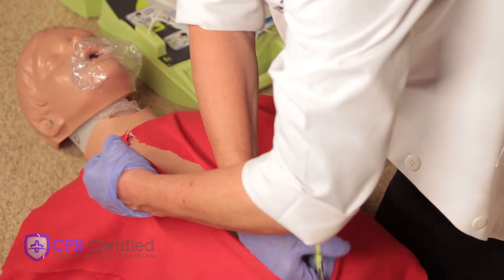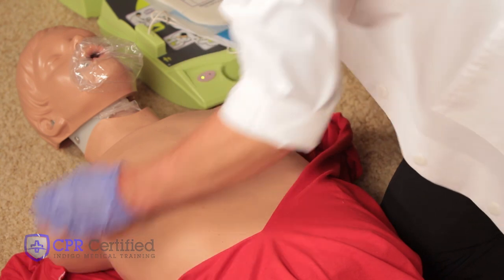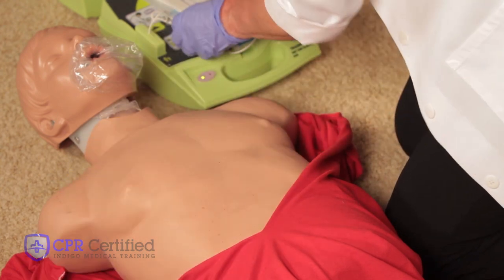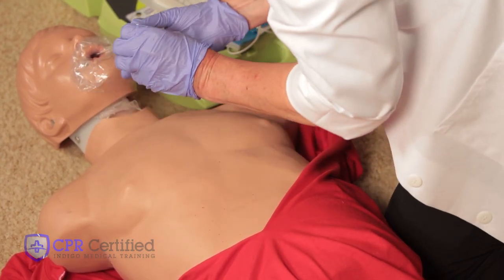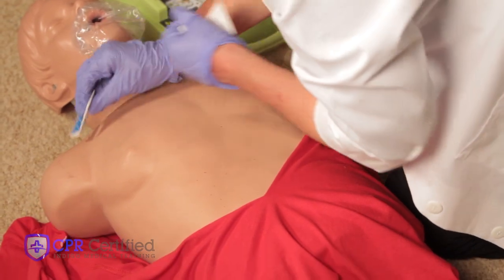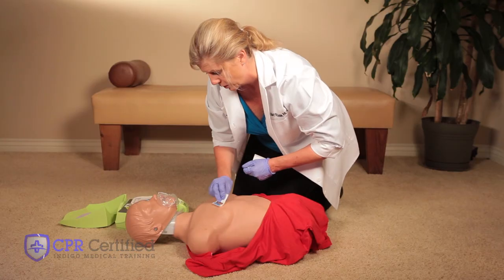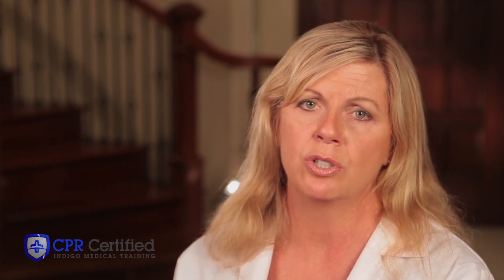If the victim has a hairy chest, use the razor supplied with your AED to shave the area where the patch is to be applied. And if the victim is wet, use clothing or a towel to dry his or her chest. It's not necessary to be totally dry though.